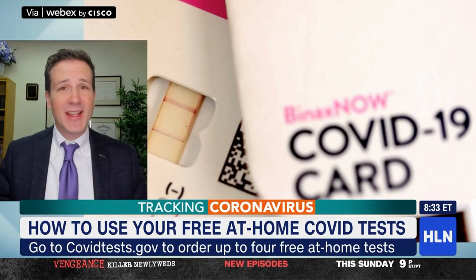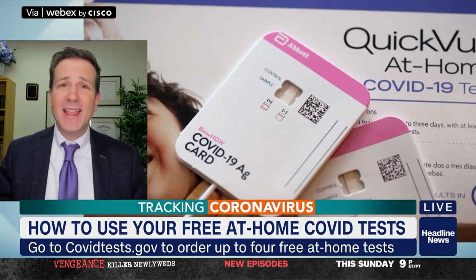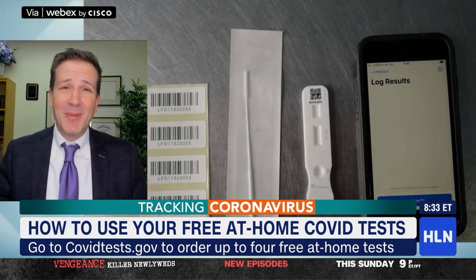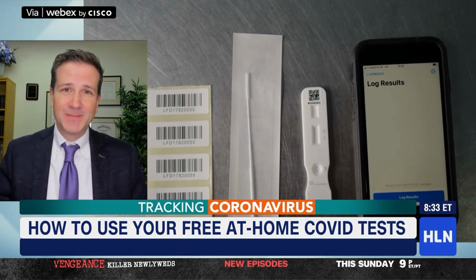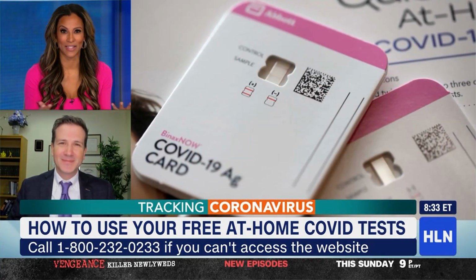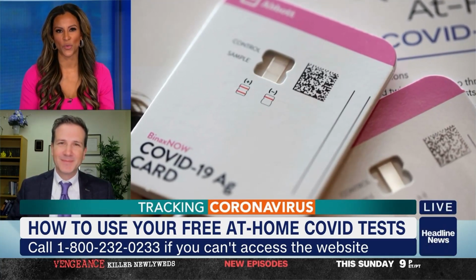And I would add, please only swab your own nose. These tests are not designed to be used in a pool fashion for multiple people to use the same test. And obviously sharing swabs can spread disease. So just yourself, just your nose. Yeah, you did hear some of those stories that families, households were sharing because there was such a shortage, a lack thereof. Now, what about when you should take a rapid test?